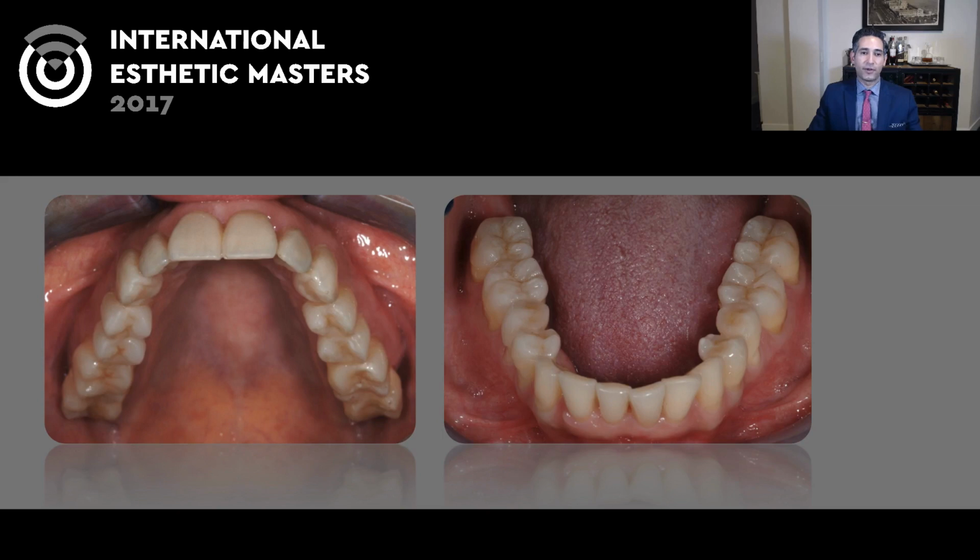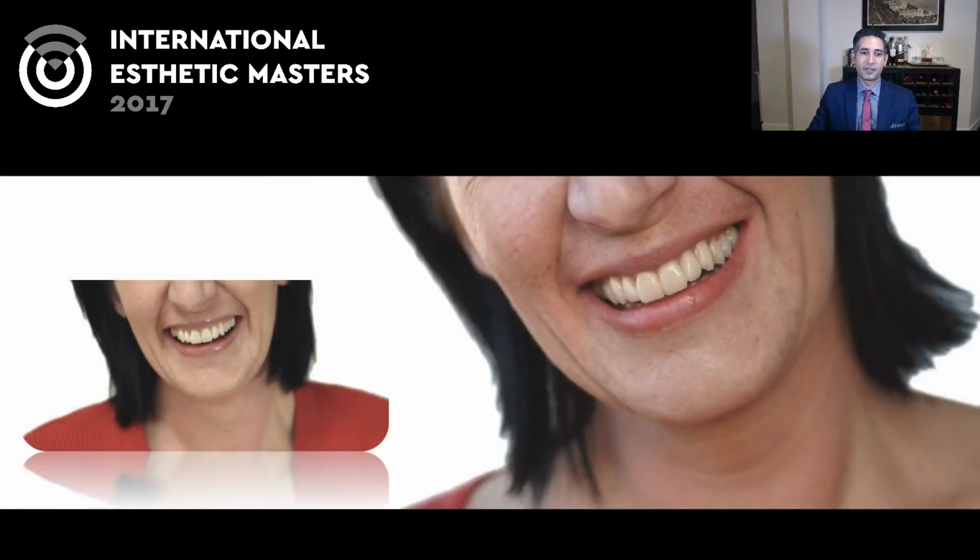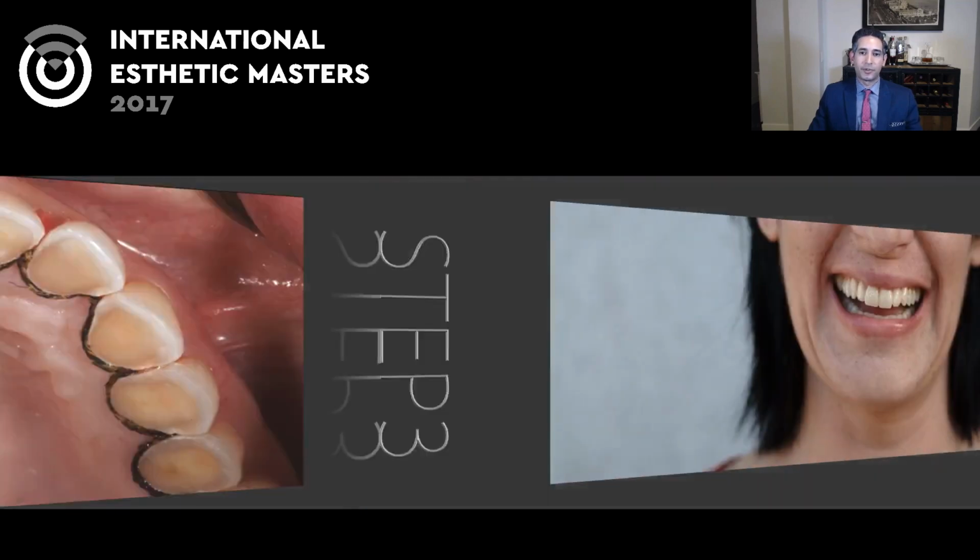So here you're looking at the final upper and lowers, and sorry, not the final, but the final of this step. You have the posterior mock-ups in place. They look really nice. I mean, it almost looks like final restorations, but remember, they are connected. And another thing that's nice to notice is during this step, we did go ahead and add the volume onto the premolar areas of the uppers, so that you can kind of get the effect of the final result, whereas in step 1 we didn't have that because the canines were a little bit bulgy. So we get a lot more of the consistency, and you can see that coming up here in the smile, where it doesn't look like there's a big transition from canine to posteriors. So another good opportunity to take photographs and so on.